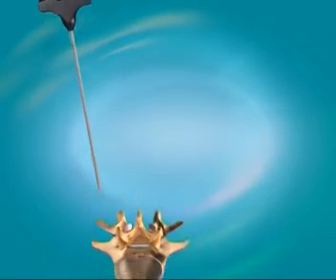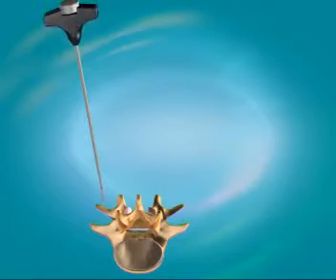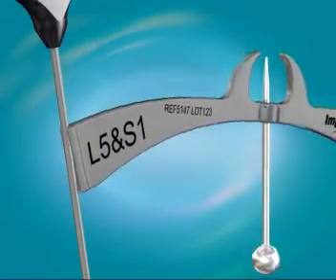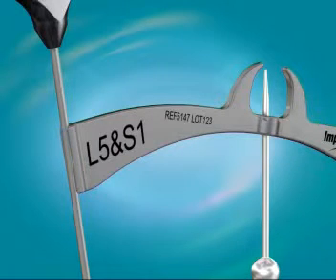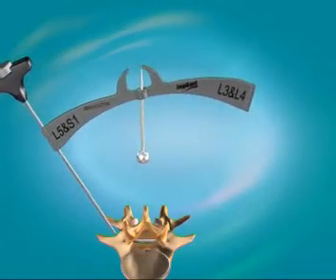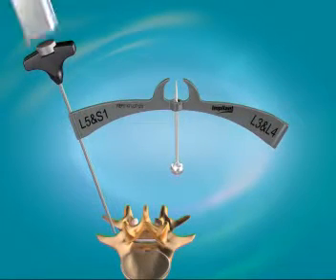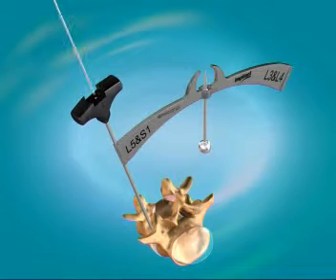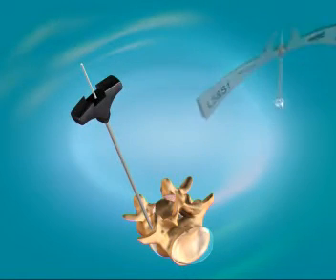The medial lateral insertion angle of the pedicle screw is important for the TOPS device to properly interface with the pedicle screw. To create the optimal medial lateral screw angle, select the trocar pendulum that corresponds to the treated vertebrae. Note that the goal is to maintain the pendulum marker within the ± 15 degree margin, so that the TOPS arms properly attach to each pedicle screw.